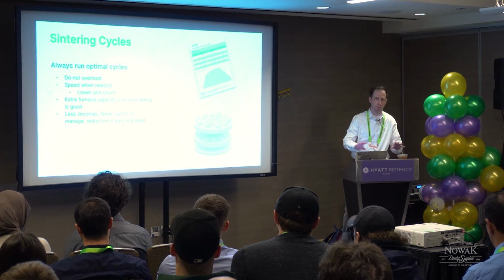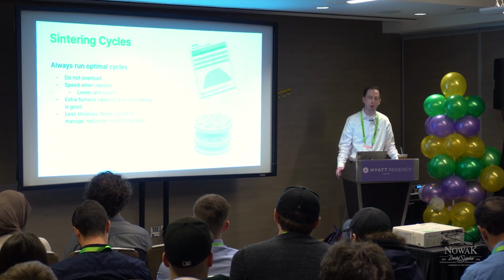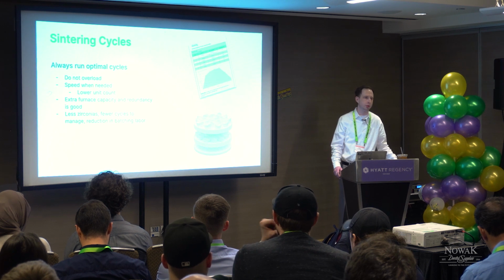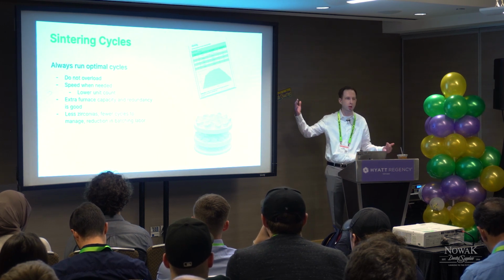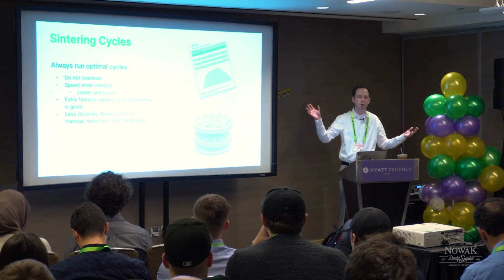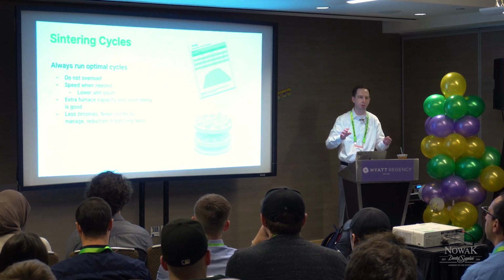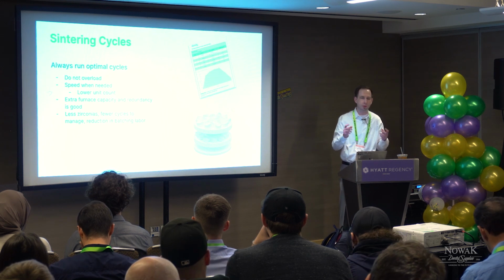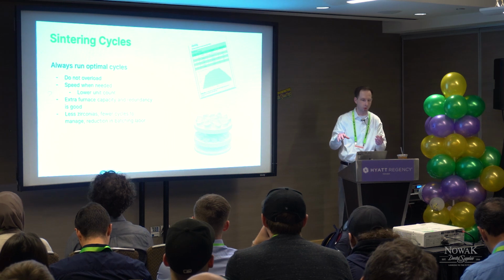Sintering is everything for zirconia. Especially with some brands out there, there could be 4 or 5 different sintering cycles for one material. And then you look at their portfolio, if they've got 5 materials, there's like 15 or 25 different sintering cycles. Think about somebody loading a furnace, picking and choosing and batching units in a sintering furnace. The simplification of your portfolio will then lead to the simplification of your workflow, is my point.